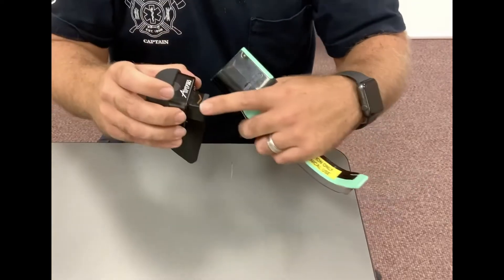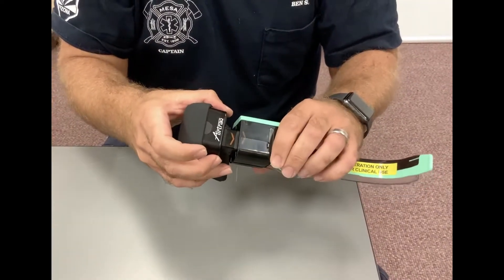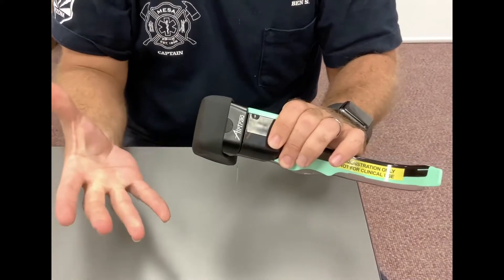Then what you want to do is move this camera to the channeled side as much as possible, slid over there, and then just slowly insert it and it will seat tighter.